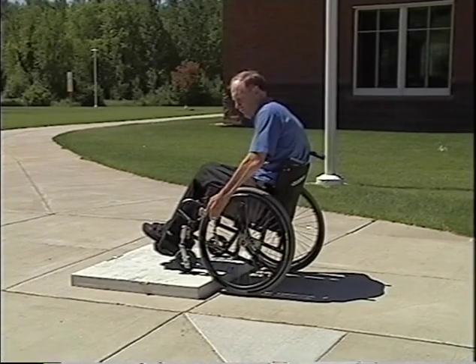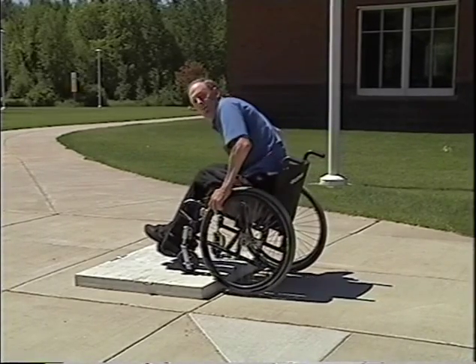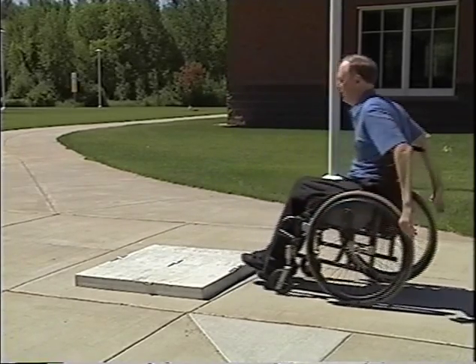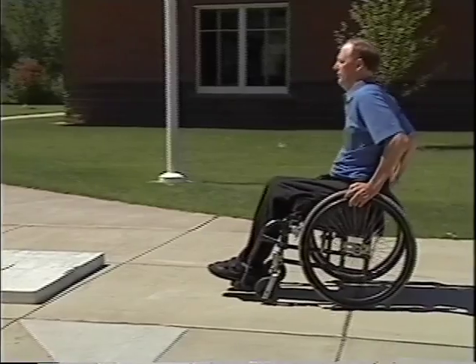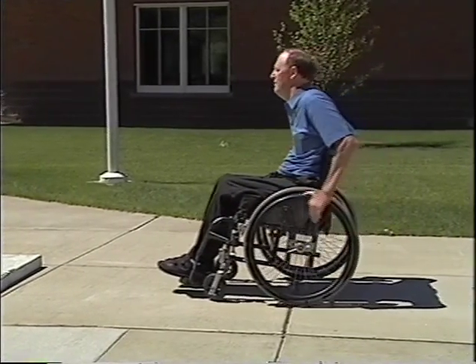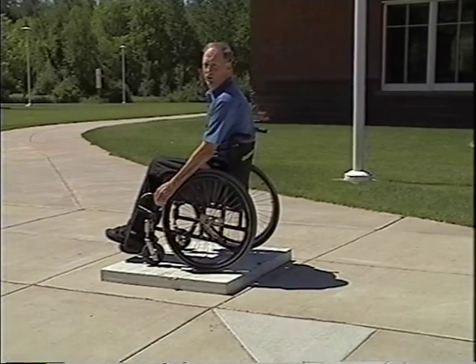Notice where my hands are — they're in front of the axles, ready to drive all that weight forward and up over the hill. Let's look at it and put it all together in one smooth motion. You don't need a lot of speed here; mostly it's just timing. And you're on top of the curb.